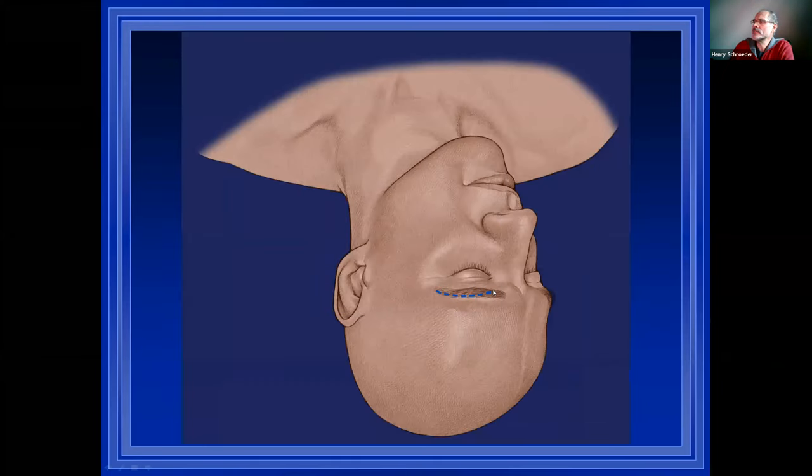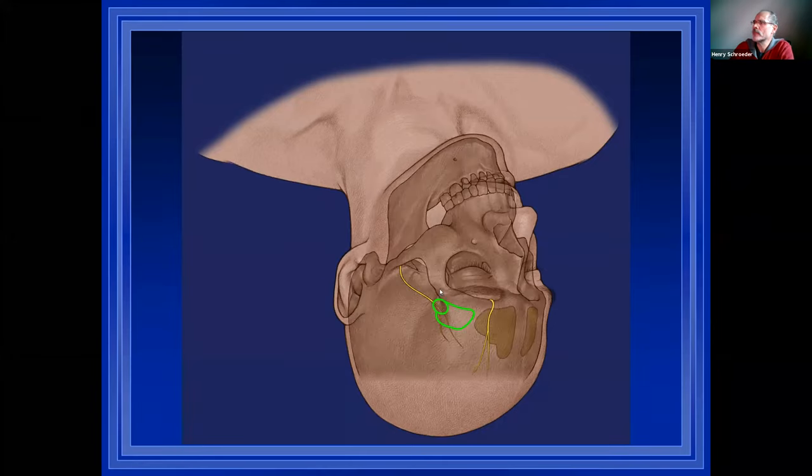So we make the incision directly in the eyebrow. Some people say it's not good because you cut through the root of the hair and then it makes a bad cosmetic result, but I cannot confirm this finding. So we just cut within this eyebrow.